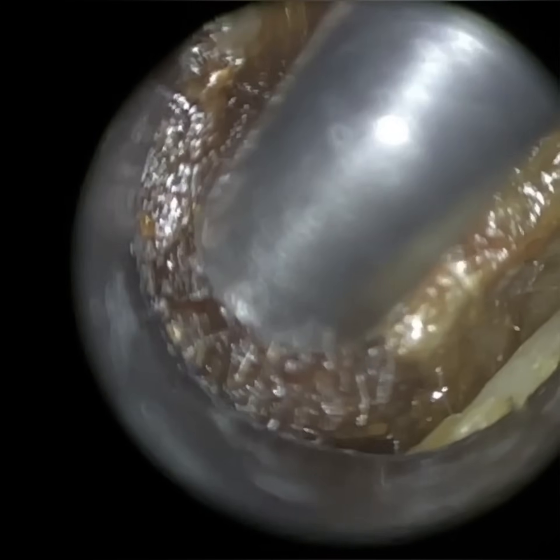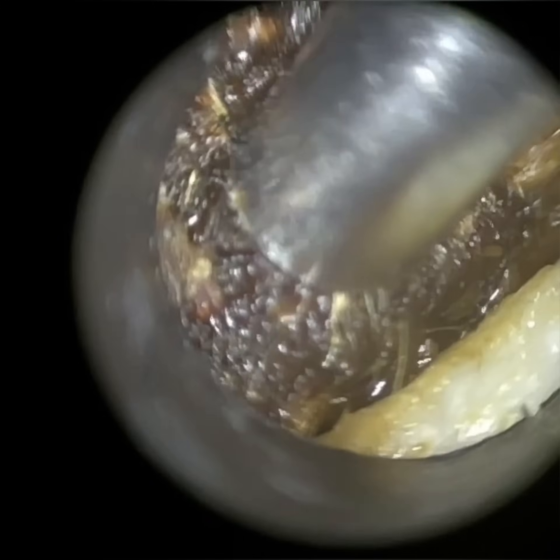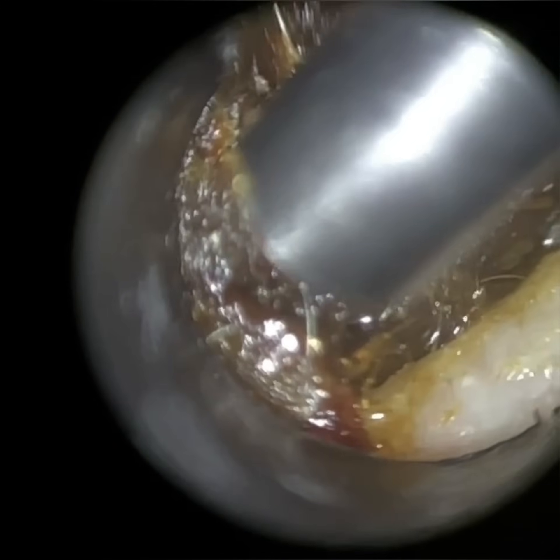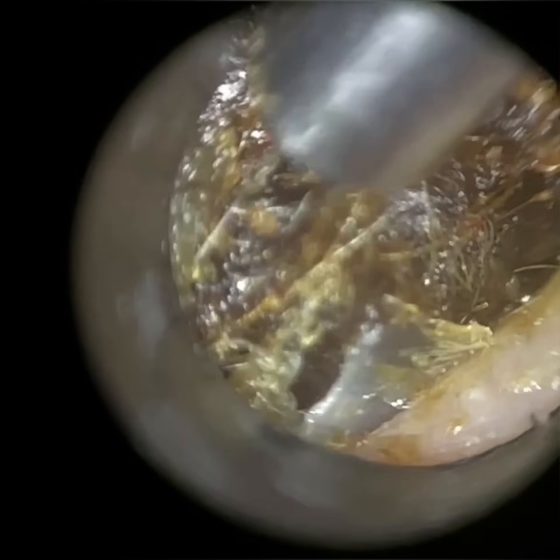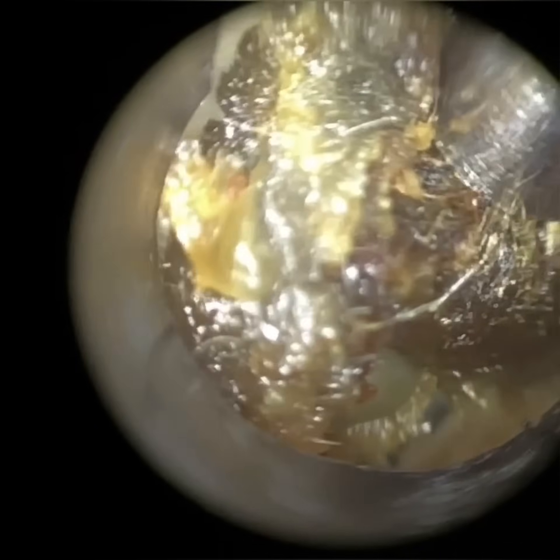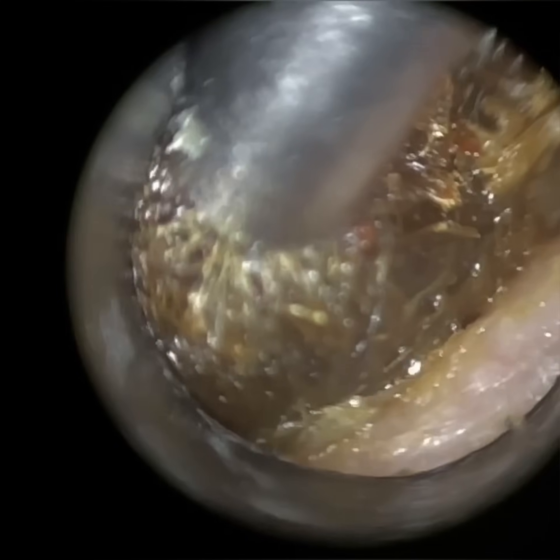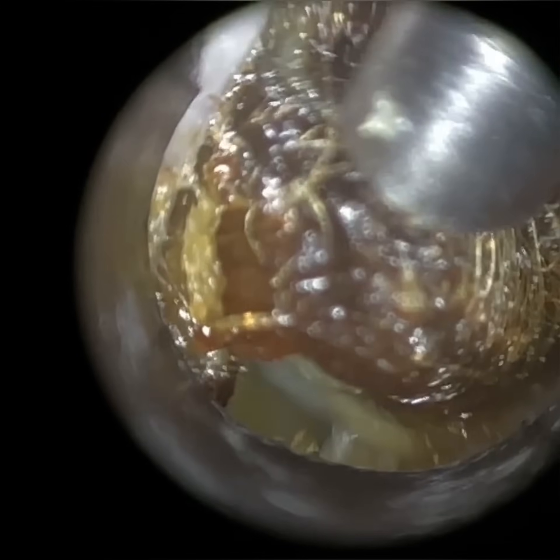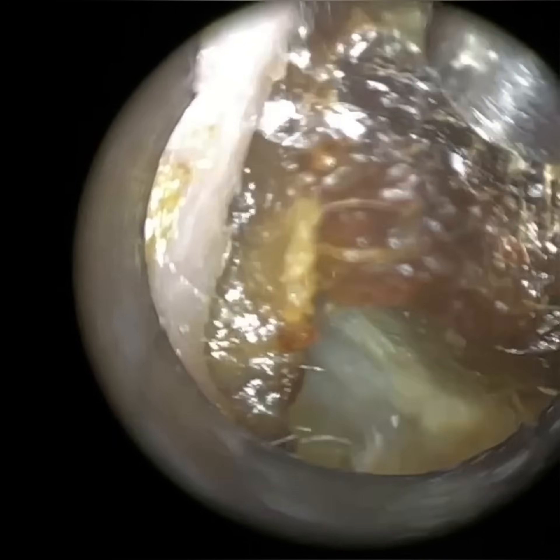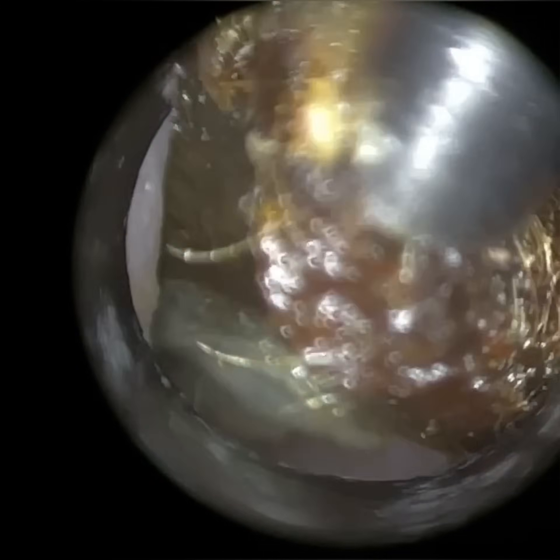So we're using our 4.25mm speculae to stretch and dilate, widen the ear canal. This is the patient's right ear. On this side I managed to remove this just with microsuction. I'm going to the floor of the ear canal — you can see those skin adhesions. We want to break those, so I'm lifting the wax plug up, ensuring the skin that's enveloped around the wax plug but is also attached to the floor of the ear canal separates from the floor of the ear canal. And then slowly but surely I'm going to wriggle this through. And again, similarly to the left, this is a really large piece of wax that we extracted.